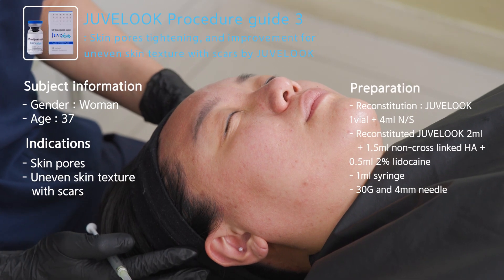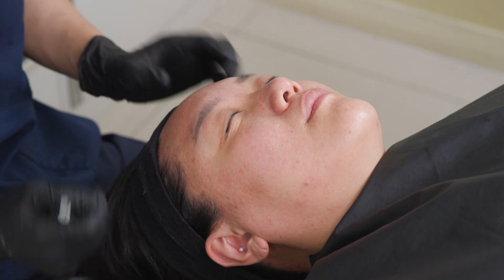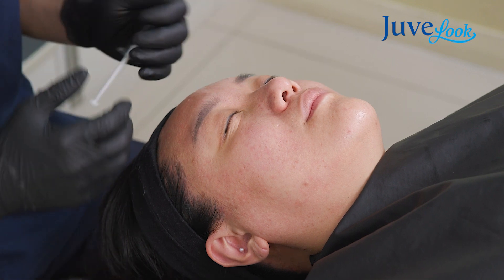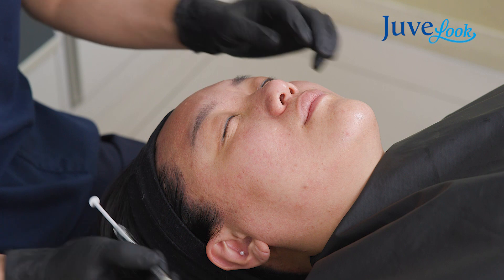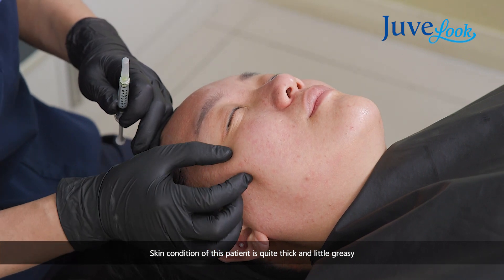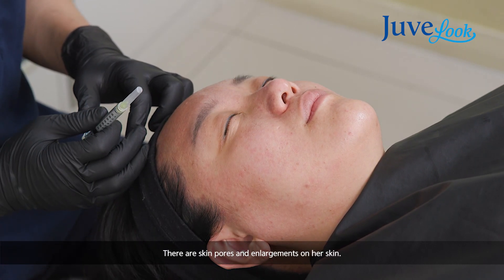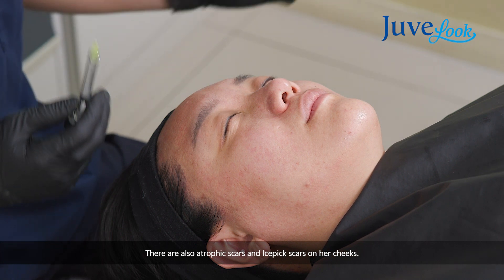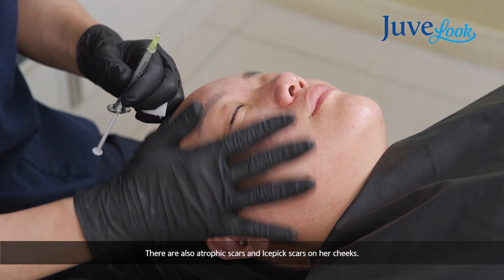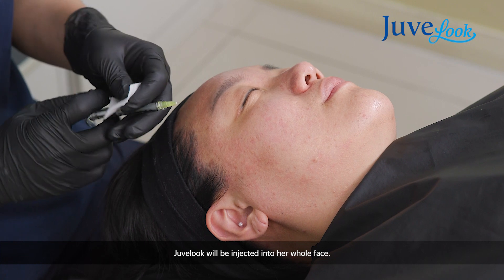This case is about skin pores and skin scars treatment. She is 37 years old and her skin is quite thick and a little greasy. That's why she has lots of skin pore enlargement, and I can see some atrophic scars or ice-pick scars on her cheeks. So using Juveluc, I will inject Juveluc on her full face, especially on her cheeks and on the glabella area to improve her skin quality, including skin pores and scars.